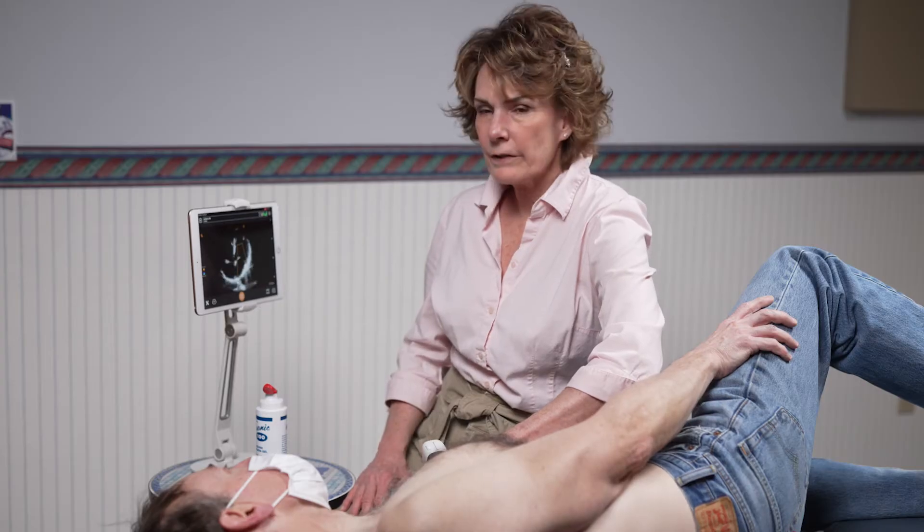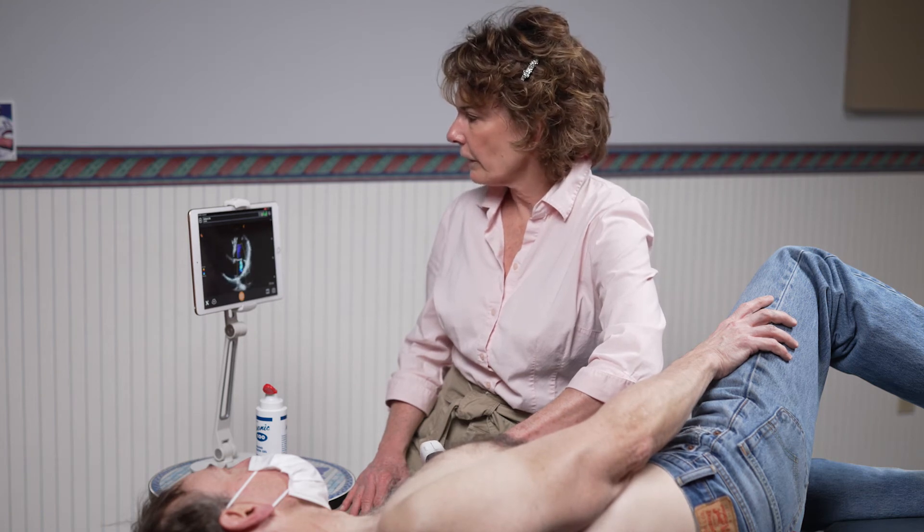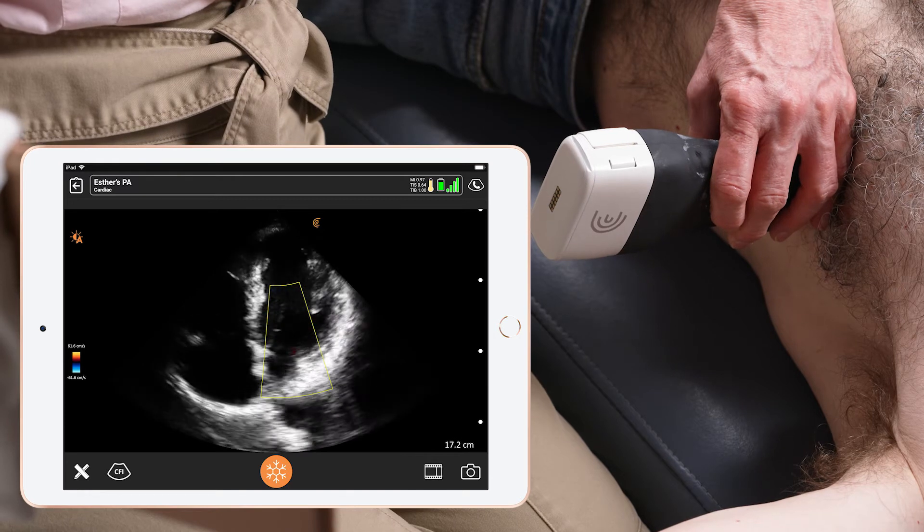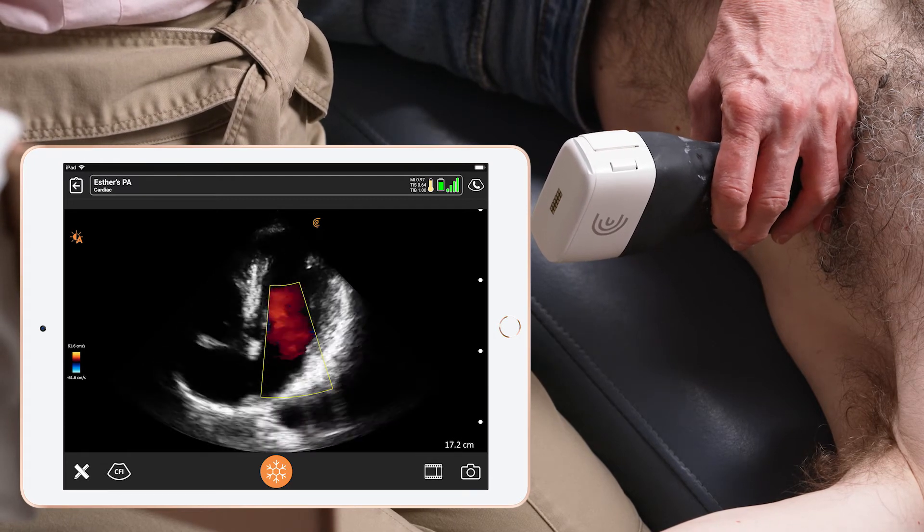We're going to start with the mitral valve. I've turned on the color Doppler, and you can clearly see the regurgitant jet coming through the mitral valve.